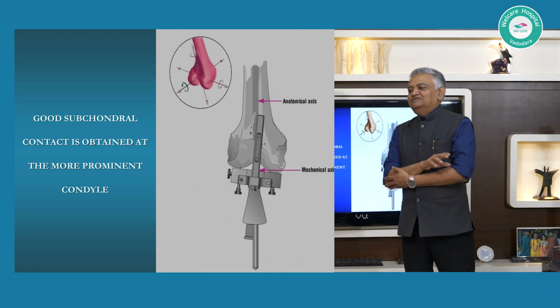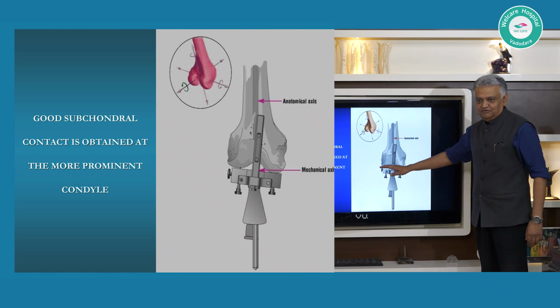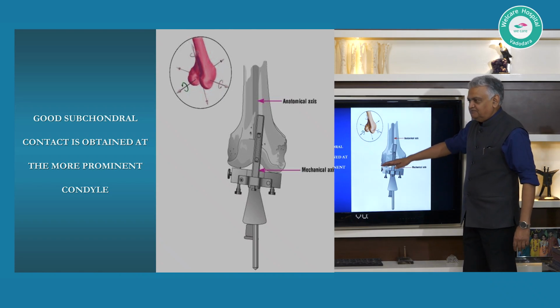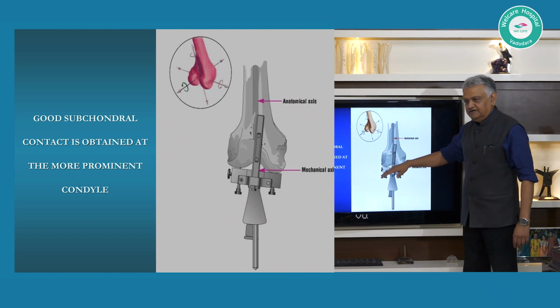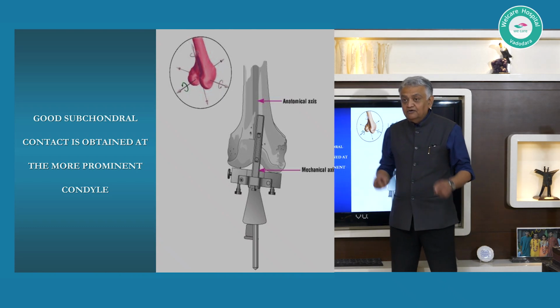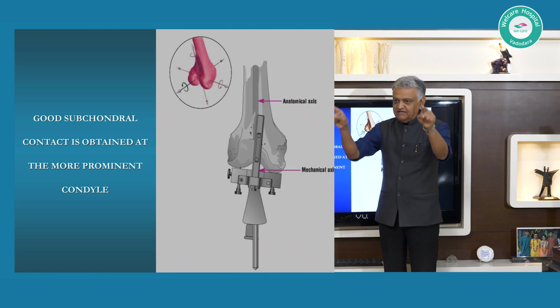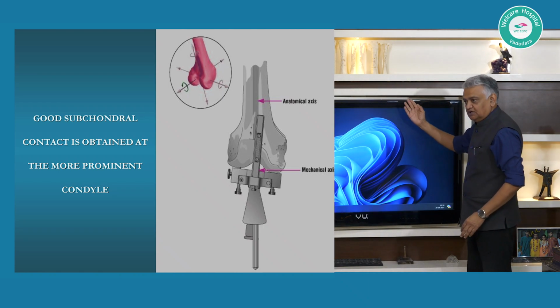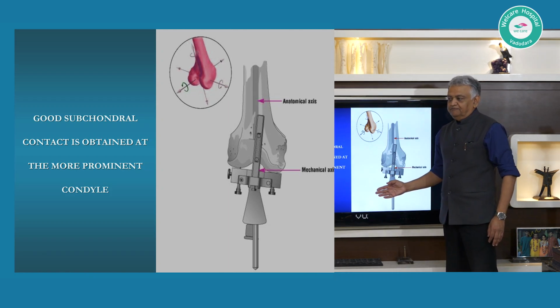Do not use the word valgus and varus for joint line related descriptions, whether it be a cut, etc. Use the words apex up, neutral, apex down, whenever you refer to the joint line, and use the words varus and valgus only when you are referring to the constitutional alignment of the limb, which means the alignment of the limb as a whole, which will include the contribution made by the femoral bowing or a tibial shaft bowing.